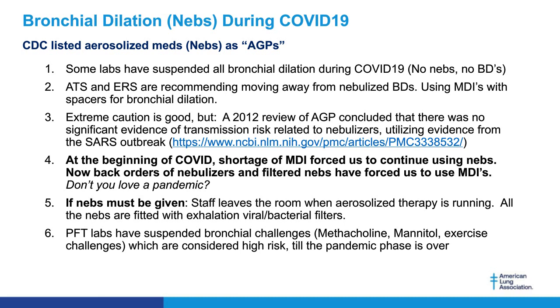Who would have thought that for a simple albuterol neb we would be gowning and gloving and face masking and N95? For me, as a person who's been directing pulmonary labs for 30 years, albuterol neb was always just a knee-jerk reaction. Anybody who wheezed, that was struggling in their respiratory, labored breathing, we would offer a neb. The CDC actually listed aerosolized meds as an aerosol generating procedure. Some labs have suspended all bronchodilation during COVID, no nebs, no BDs.